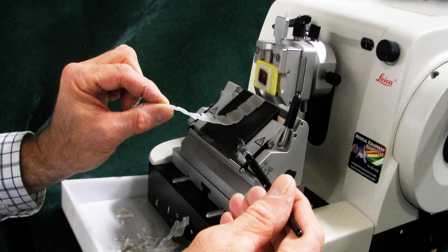After fixation, the paraffin blocks are cut into thin sheets using a microtome. The microtome is a tool used by histologists to put tissue slices onto slides so that they can be viewed under the microscope.